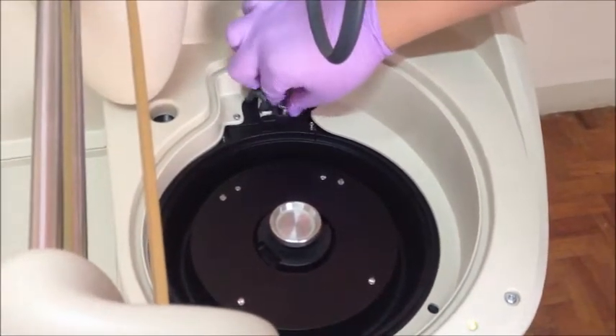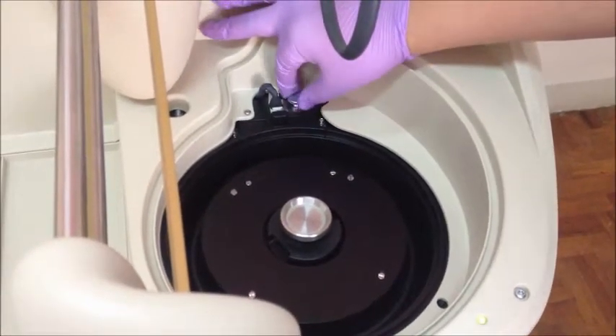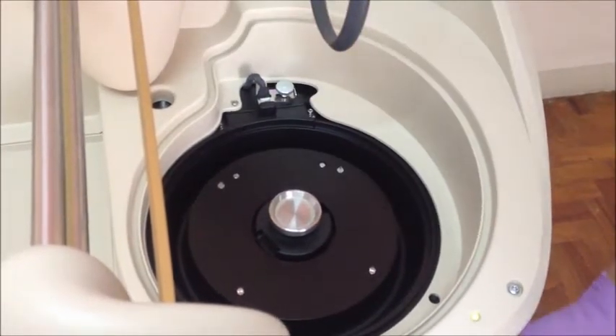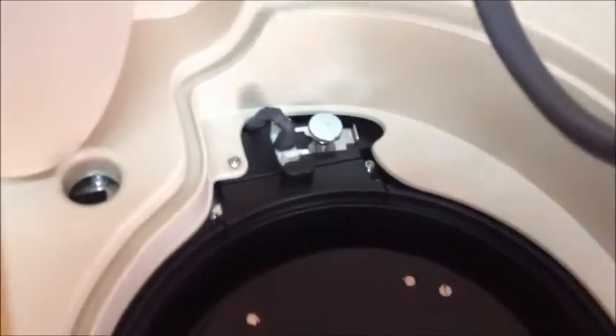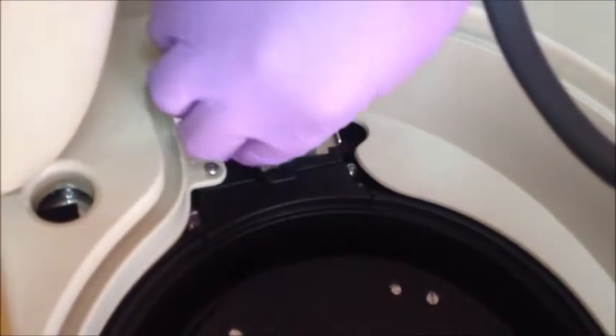On the optical group, the lamp socket is locked by a metallic plate holder. Loosen the thumb screw and unlock the metallic plate holder by pushing it away from the lamp socket. Then pull the lamp holder carefully.